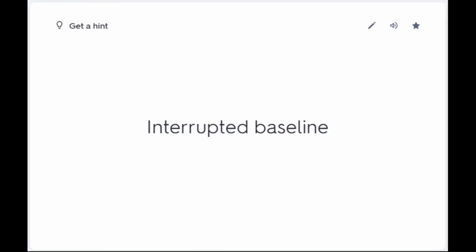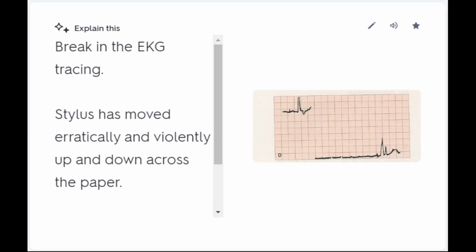Interrupted baseline. Break in the EKG tracing. Stylus has moved erratically and violently up and down across the paper. Disconnected or broken lead wire.